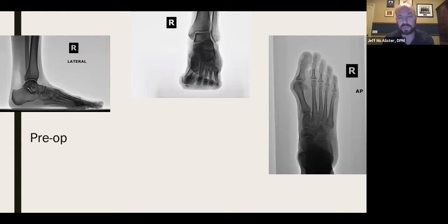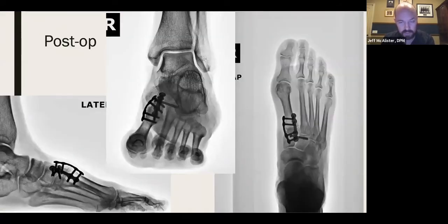So we're looking to do a realignment or a reconstruction of her medial column, or spine of the foot. Appropriate hindfoot to forefoot relationship, so we're not thinking that we have to do anything else. And we're moving on to a first TMT fusion. So next. I typically utilize a cut guide system that allows me to kind of spin it, if you will. And so what we're able to do here, you can see that sesamoid axial, we're able to realign that sesamoid axial well. This is at about 6-8 weeks out or so.